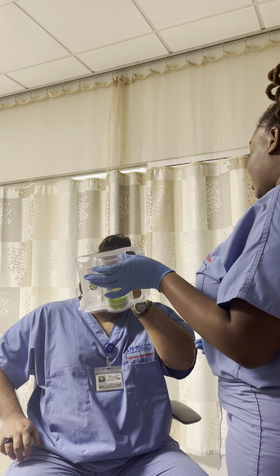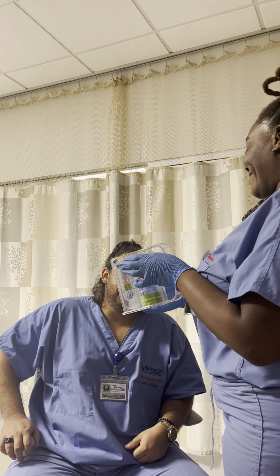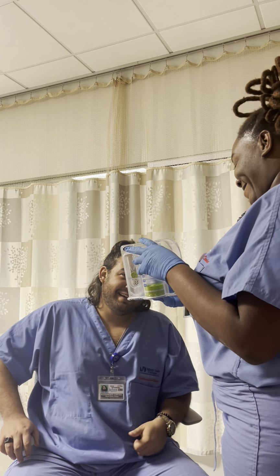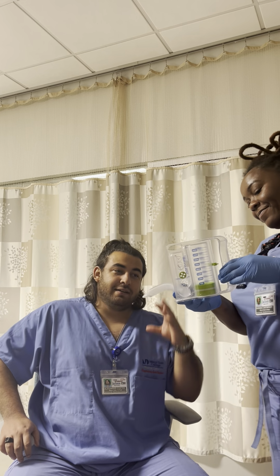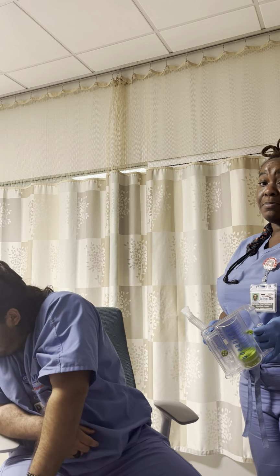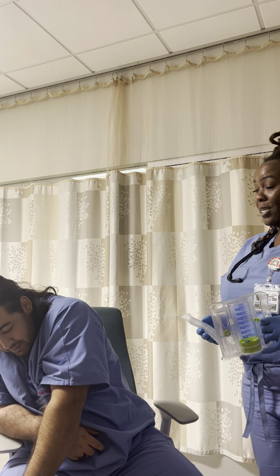Hold up. Okay. Patient having a time. This is how you know it's working. Is open up those lungs.